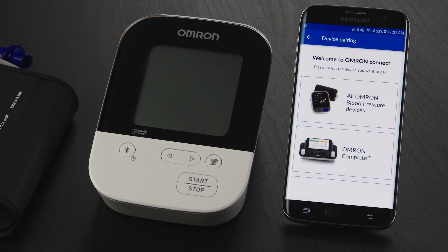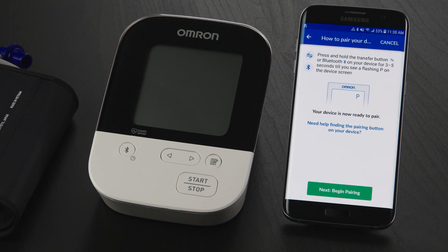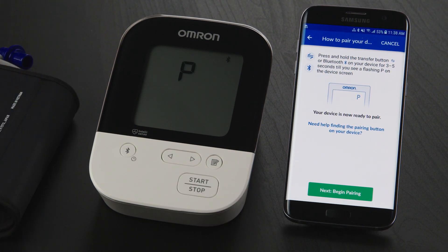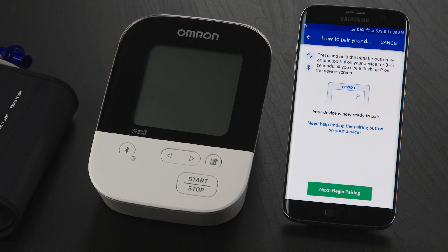From here, select the All Omron Blood Pressure Devices box, then tap on the Next Pairing button. Now it's time to place your Omron device in pairing mode. Press and hold the Bluetooth or Transfer button for 3 to 5 seconds. When you see a capital letter P flashing, your monitor is ready to pair.